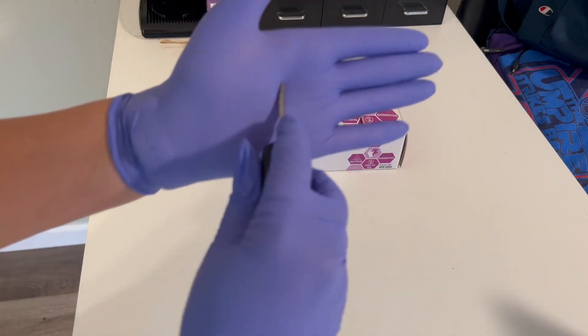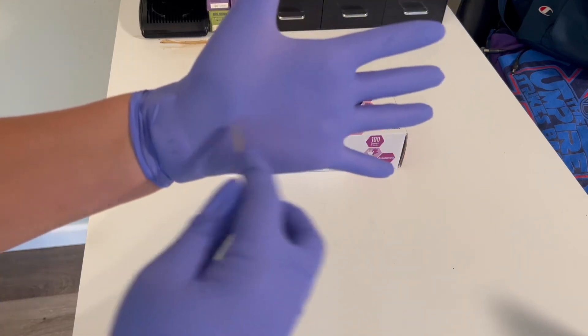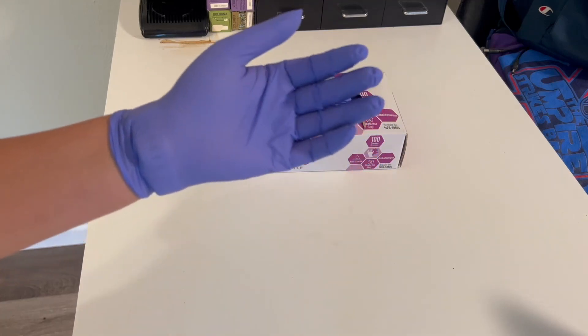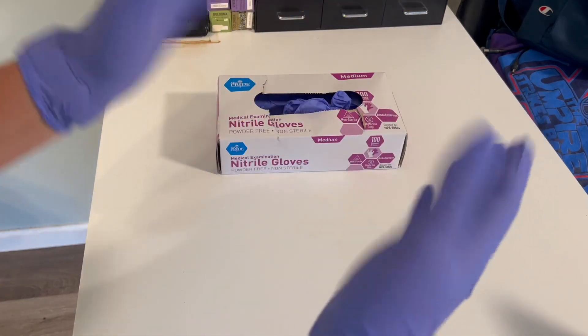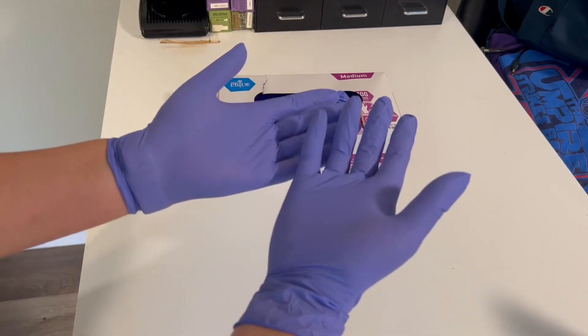I'm trying to scrape my hand a little bit with a key and it withstands quite a bit. I have had some rip a few times, mostly in the fingertips, but overall for just disposable exam gloves, they're pretty durable and I'm pretty happy with them.